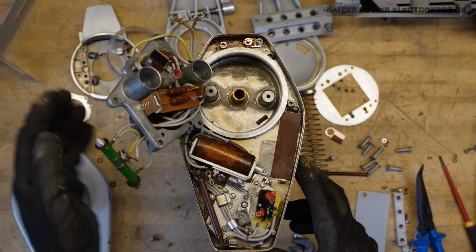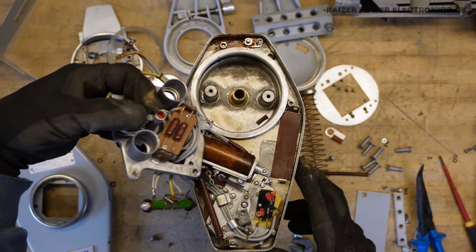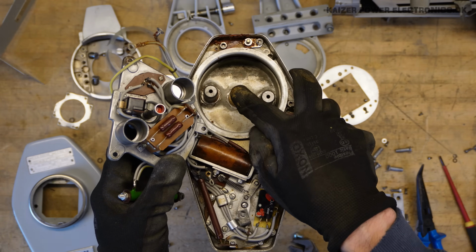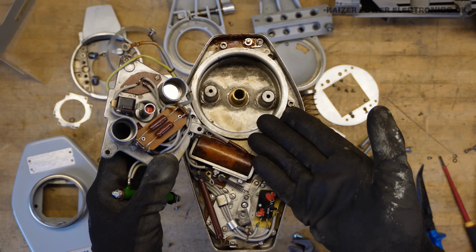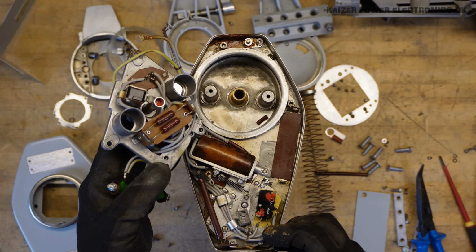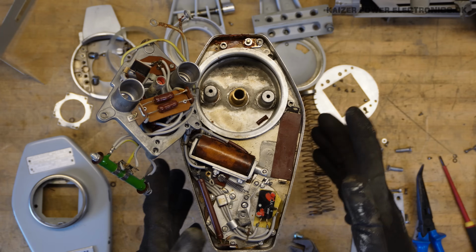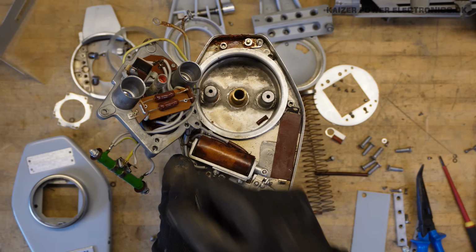This is, okay, maybe some kind of overheating switch. Well, that makes sense. There's actually a switch sensing this movement, for when it's pushed too much out. That is clearly overheated as it has expanded too much, and it will have a thermal shut off that way. Actually quite clever, because then you don't need to measure at many points to find what is overheated, since all kinds of heating would expand the oil, so this catches everything.